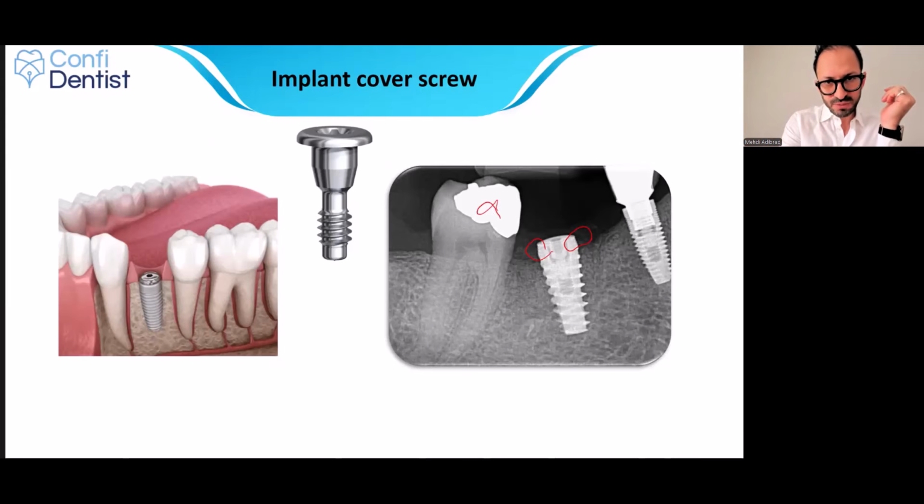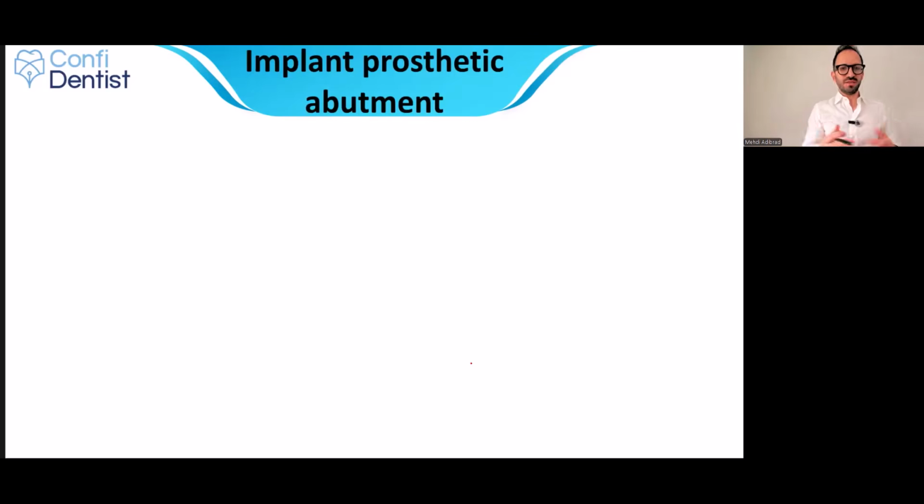So yeah, some amalgam restoration, and I don't see evidence of periodontal bone loss. And the very interesting thing, I don't know if you guys already noticed or not, is this. Okay, always pay attention to these small details. You can see there is a retained root tip here. Look at the retained root tip. You can see even the gutta-percha inside it. Okay. So it means when they removed the tooth, they didn't take an X-ray and the root tip was left behind. Anyway, let's continue.